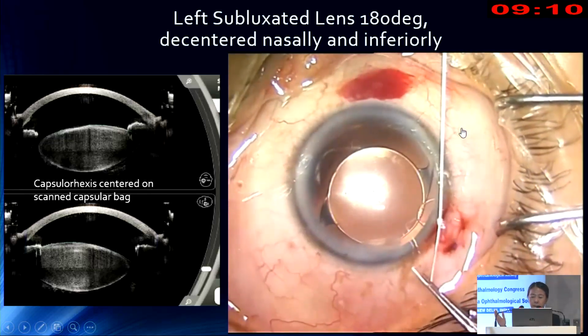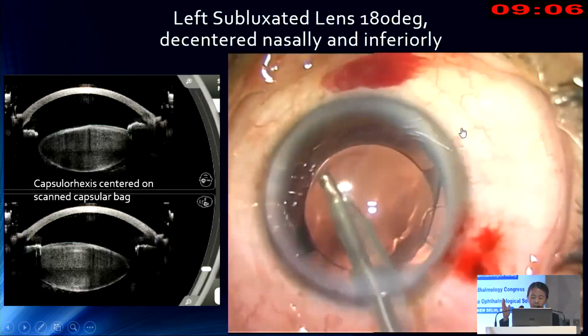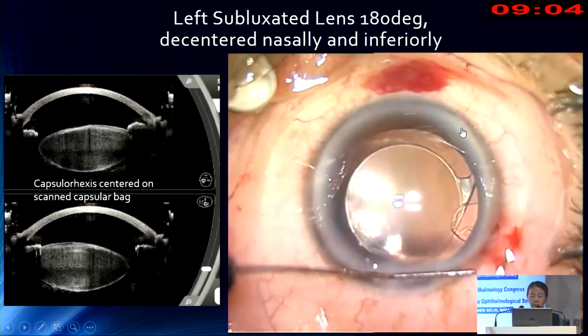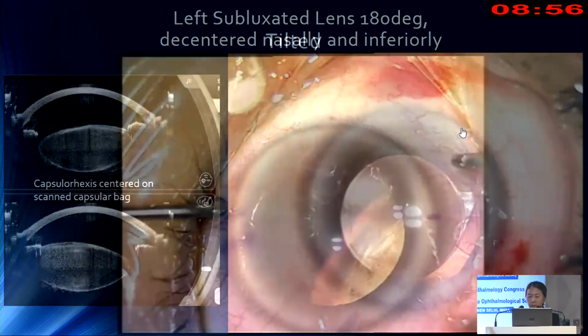So I do not fix the bag until my lens is in. It tells me exactly where that bag is, and I always tighten a bit more when you're doing 1 point fixation, because that knot will settle 2 mm posteriorly from the limbus. Okay? Then you have an IOL that's centered.